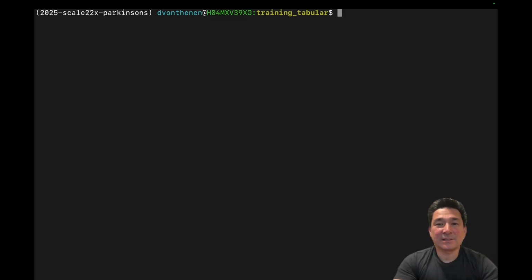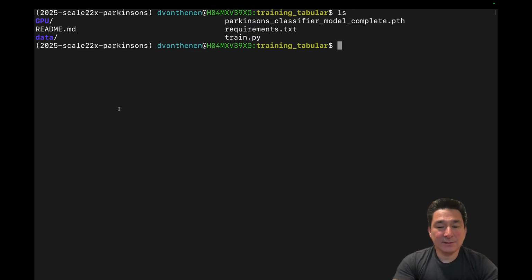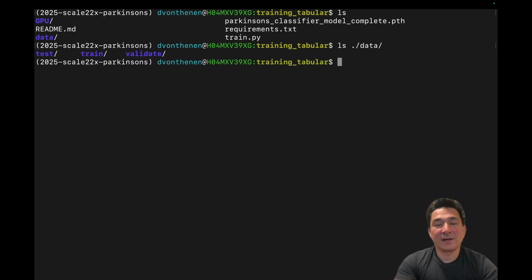After you've created and extracted all of your CSV files from the original videos, you can place them into this data folder, and in the data folder, it has a very specific configuration. So test, train, and validate, and each one of those folders is going to have a normal and a Parkinson's folder. Then to start the training process, you just run python train.py, and it'll start the training process based on the CSV files contained in those folders.